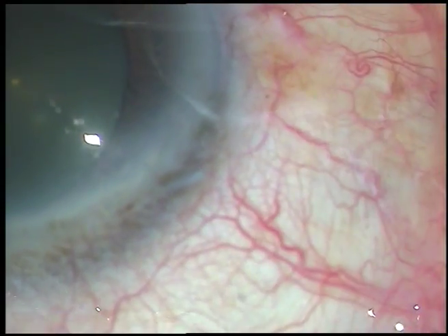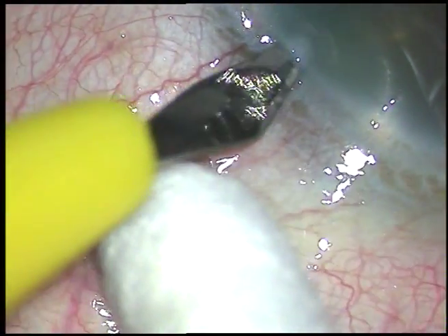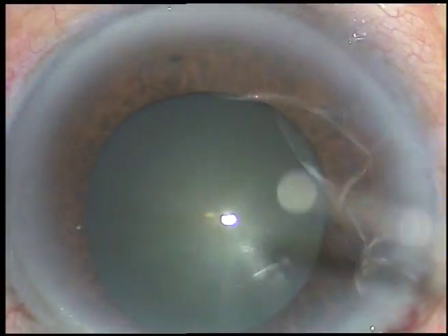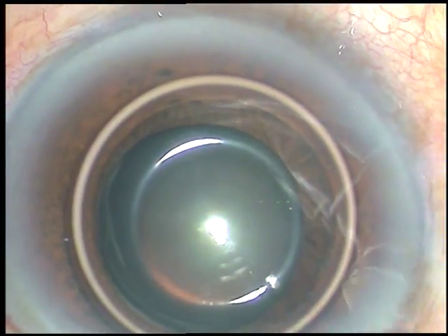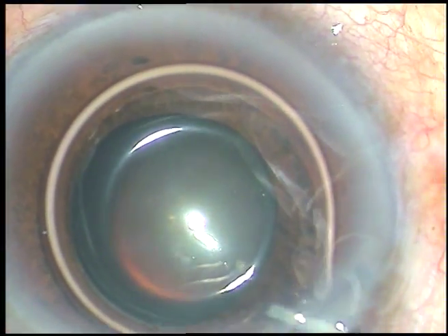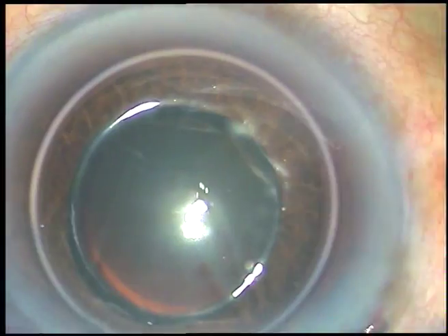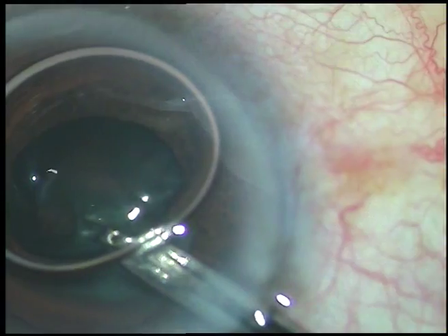I made the main incision and now I am making the side port about 3 o'clock hours away from the main incision. Now, I want to stain the capsule with trypan blue dye because the pupil may get smaller when I go inside the anterior chamber with the tip of the phaco handpiece. At that time I may need to place iris hooks, so it is very important to stain the capsule to identify the anterior capsular rim.